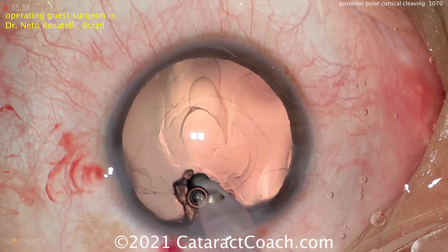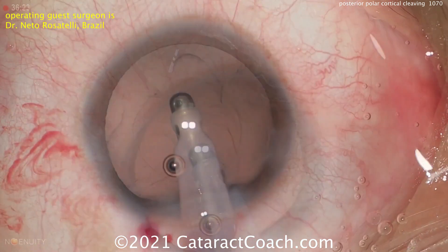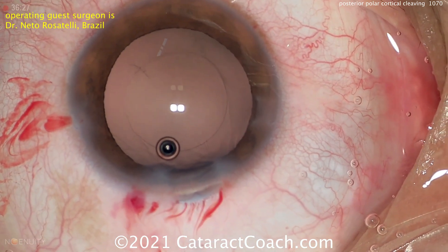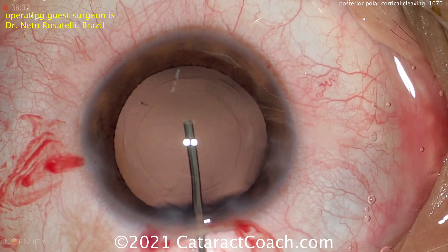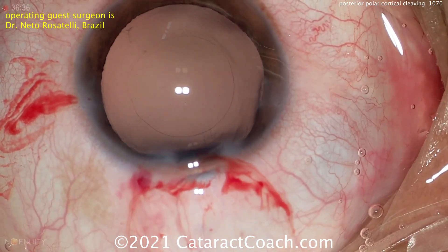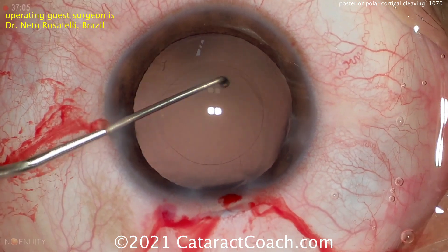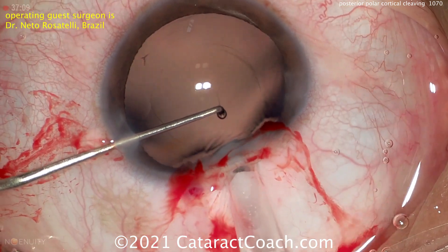So a very unusual technique. In the past I've advocated use of viscoelastic — using a dispersive viscoelastic to visco-dissect the cortex and epinuclear shell away from the capsular bag. In this situation, Dr. Rosatelli is showing us he can use a mechanical approach, using this hook instrument, which is like a chopper with a blunt tip, to mechanically separate the lens material from the capsule.